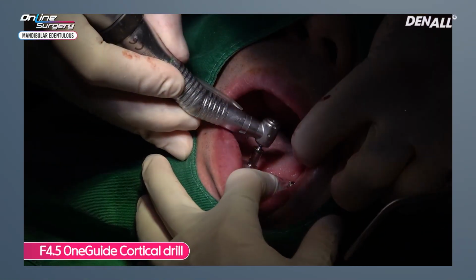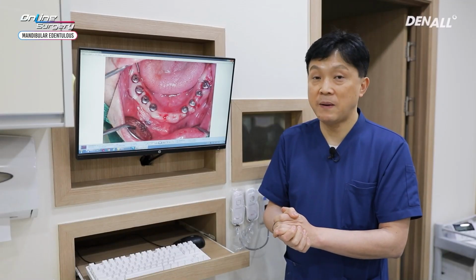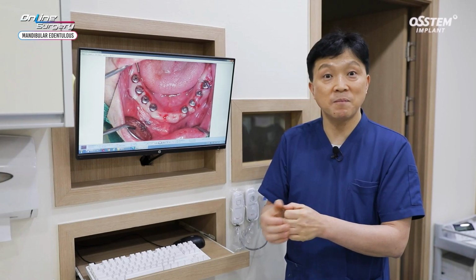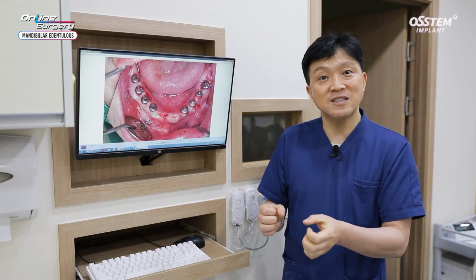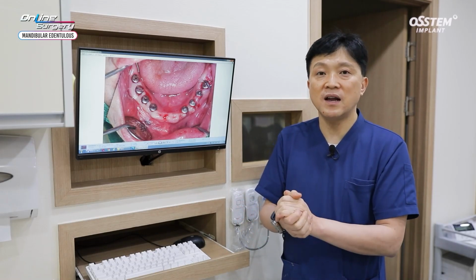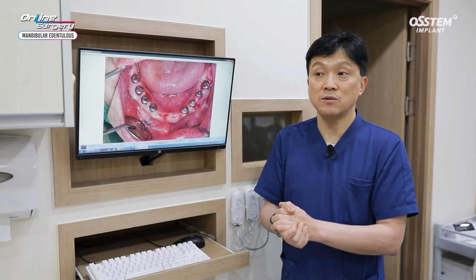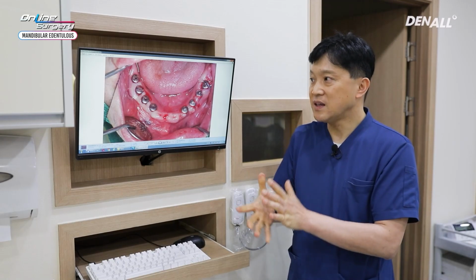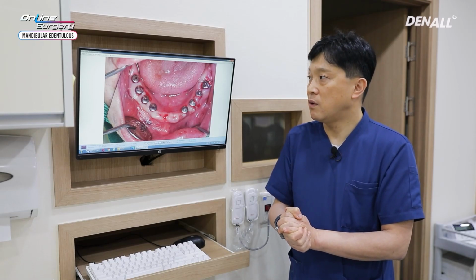You need to place the implant after expanding the hole size in order to prevent excessive insertion torque or implant driver getting stuck. I want to emphasize again, when you do a full mouth case and if the implant driver gets stuck, then things can get very difficult. In that case, you need to remove all the anchor screw and remove the template and then connect the anchor screws again to proceed with surgery. In that case, then time-wise, it can be very devastating, and therefore I do not recommend placing the implant hand-driven if there is excessive torque. In the case of this patient, I believe that there will be no major issues in doing loading after 8 weeks.